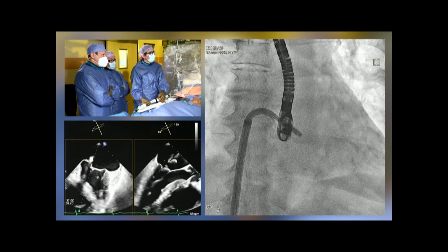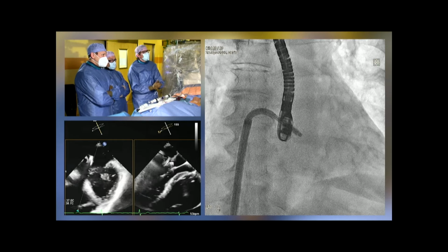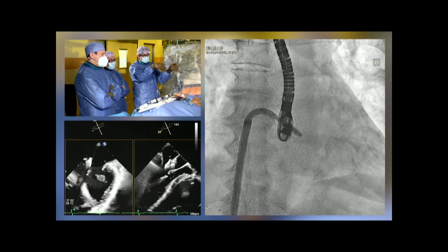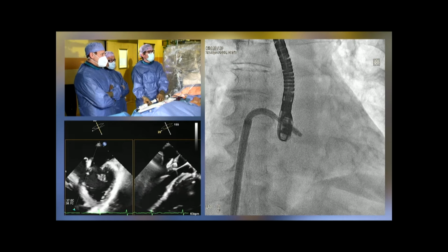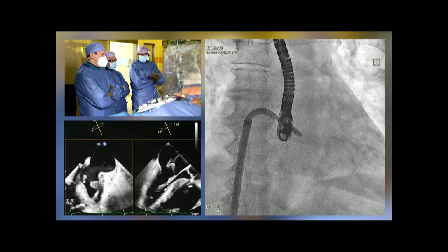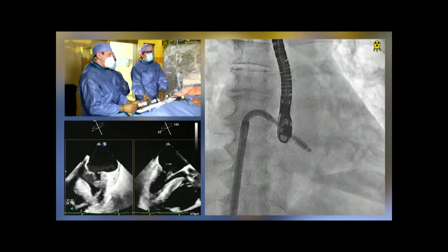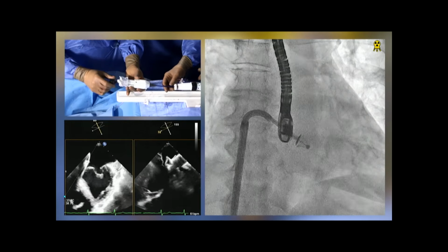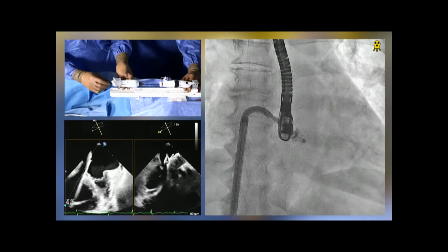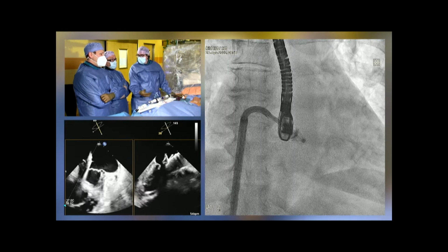So what do we think about the travel, the path of the device? What we see nicely here is the power of the MR and how the device is pushed away once we are at the epicenter of the regurgitant jet. But that's to be expected. I think it's not bad. I think that's good. Let's open it and check the clasp, because we will certainly use independent leaflet grasping here. How often are you doing independent grasping as the first grasp with this device? We go for simultaneous grasping unless it's really needed to do independent.